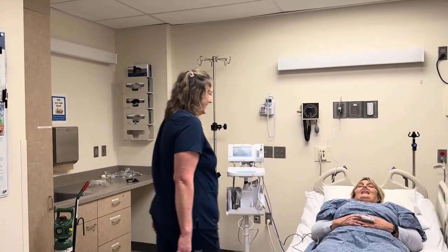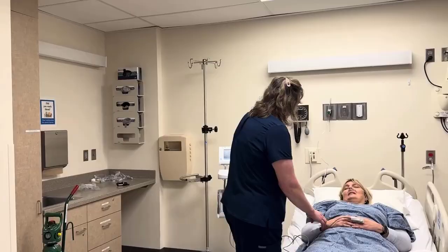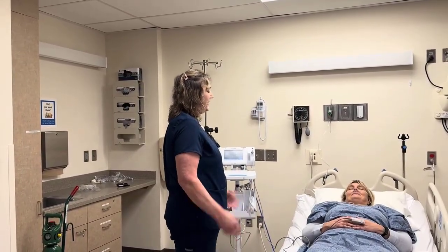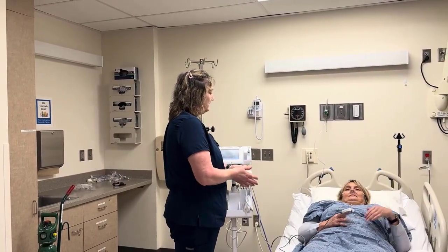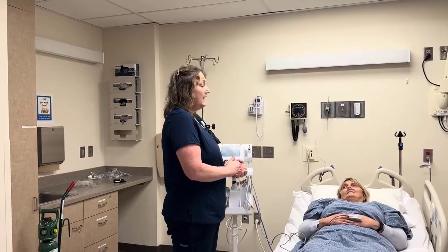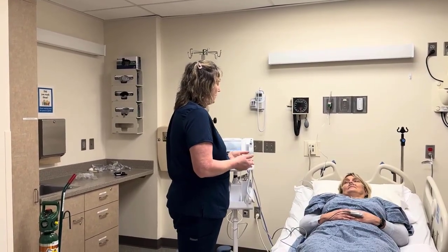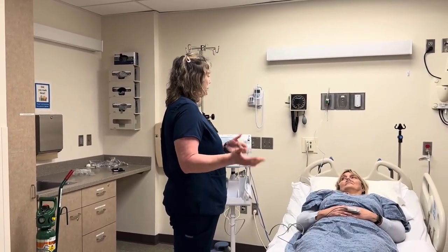So I'm going to come in the room. Hi Michaela, how are you today? Can you please verify your first and last name and date of birth for me? Yes, Michaela Murphy, June 9th, 1966. Great. So what we're going to do today, Michaela, is I'm going to do a home oxygen eval. And what we're doing is we're checking to see if you qualify for oxygen at home so that when we discharge you, we can get you to a safe discharge, okay?